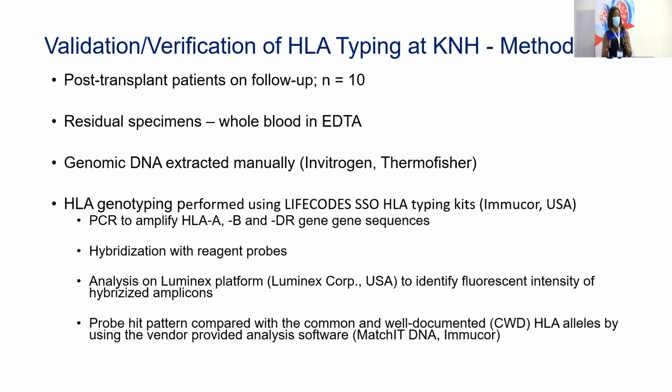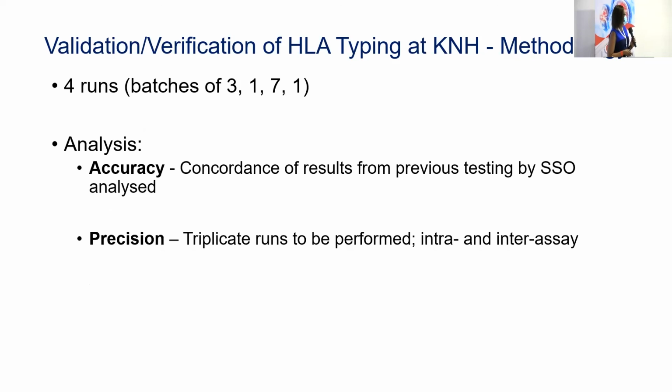We took whole blood in EDTA. That's important because in the validation process, you need to use the actual specimens that you will be using for your clinical testing, and that is what we intend to use. The rest of the slide just gives the details of how we went about performing the testing. I won't belabor you with that. We ran 4 batches. On the first day, we tested 3 patients, and then 1, and then 7, and then 1.